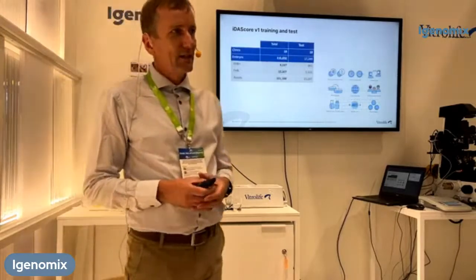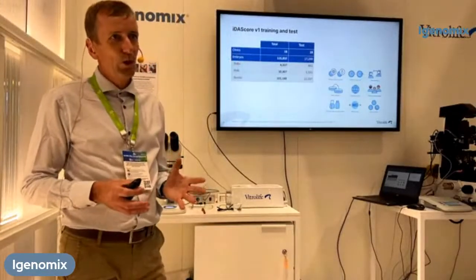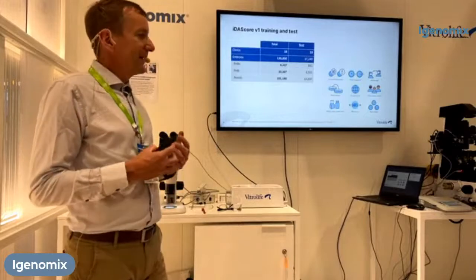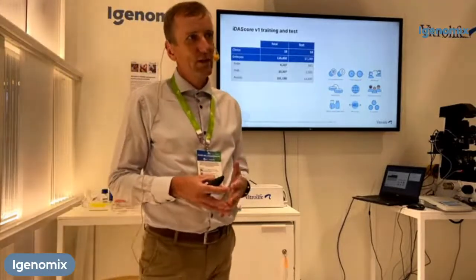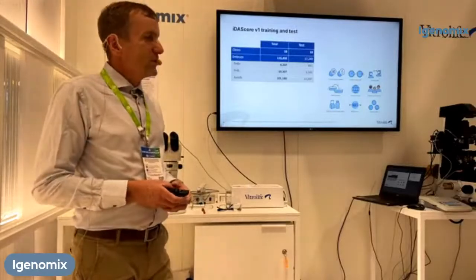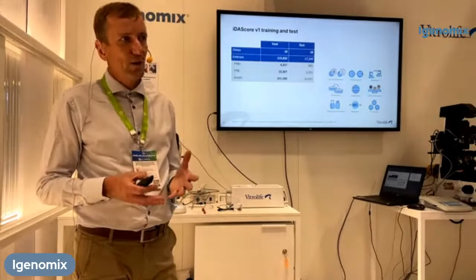Going back to the data, we use 18 clinics worldwide, so it's a very large data set covering a lot of different clinical practices, stimulation protocols, lab procedures, etc. In total, we have 115,000 embryos, so we have a lot of embryos to train on.